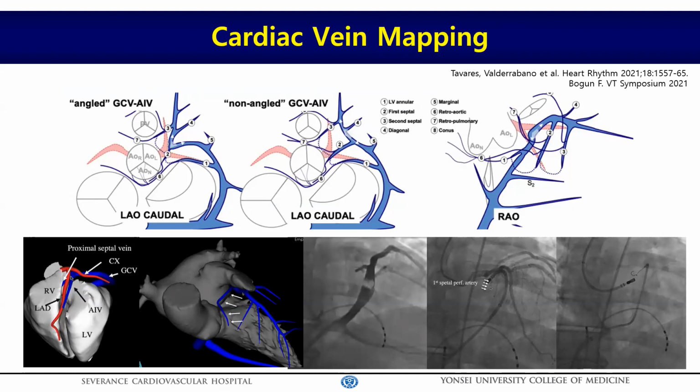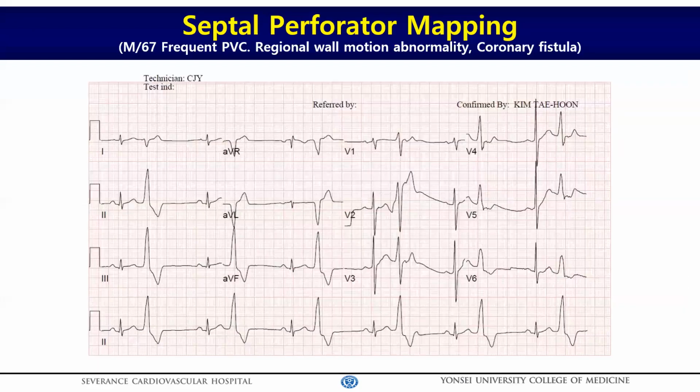A coronary vein map with a microcatheter provides a good landmark during ablation, estimating the location of the coronary arteries. You can even use the coronary vein for alcohol ablation. So I recommend mapping the coronary vein for VT from the LV summit, basal anterolateral wall, or crux areas.